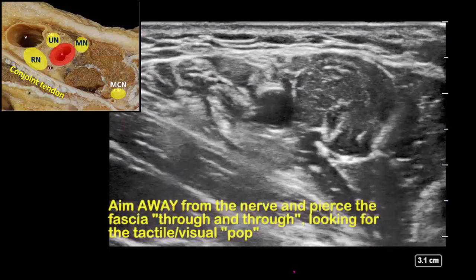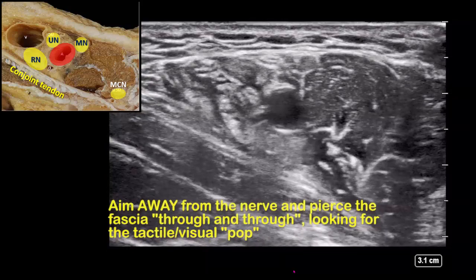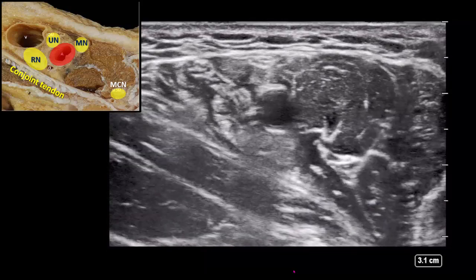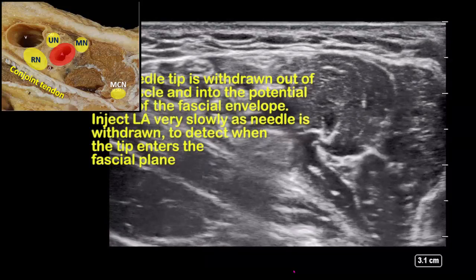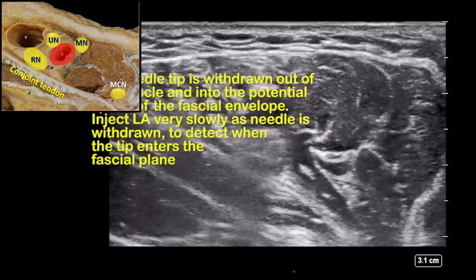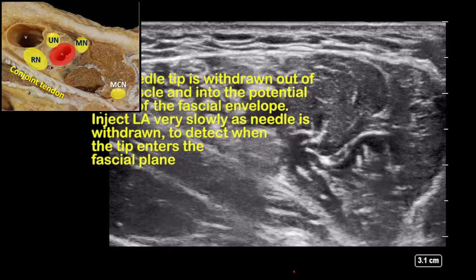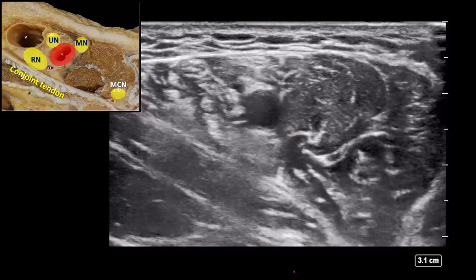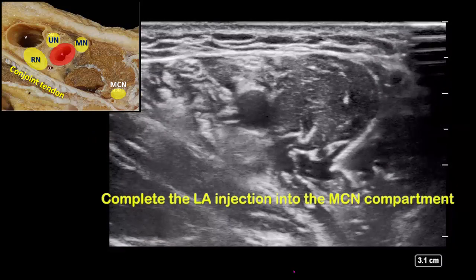When piercing the fascial layer, the needle will inevitably go through and through with a tactile and visual pop. Once this has been seen, withdraw the needle slowly while simultaneously injecting very slowly. Once the needle tip re-enters the fascial space, it will distend and local anesthetic will surround the nerve. Finish the injection here with approximately 5 mils of local anesthetic.